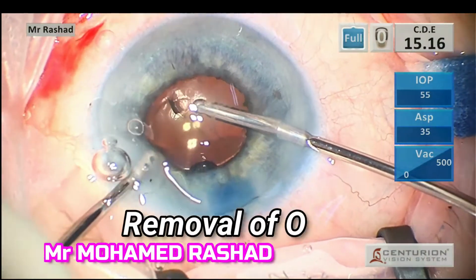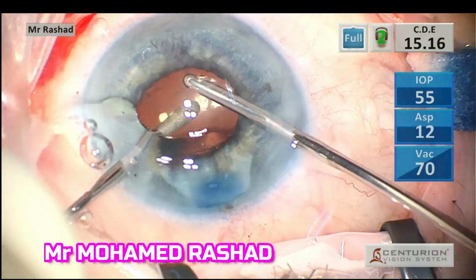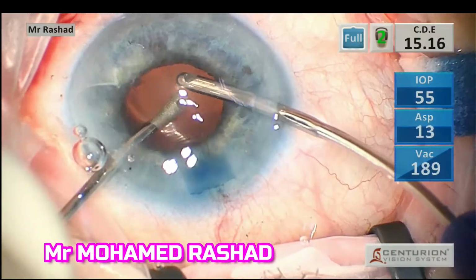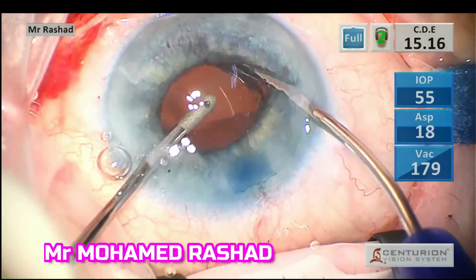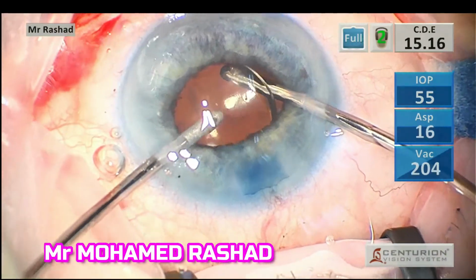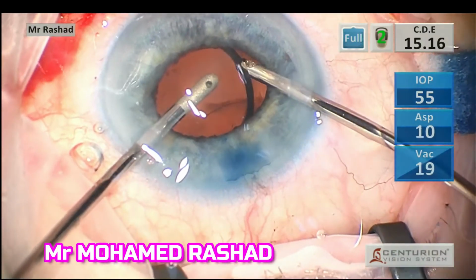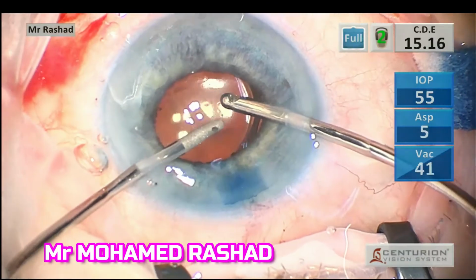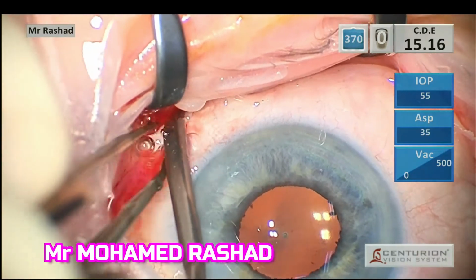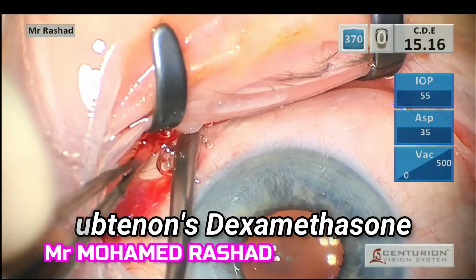Then removal of the OVD from in front and from under the IOL. You can see that the iris border doesn't have damage at this stage, and removing all the OVD will prevent any pressure spike postoperatively. I usually inject dexamethasone subtenon at the end.